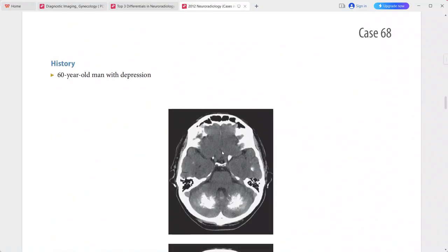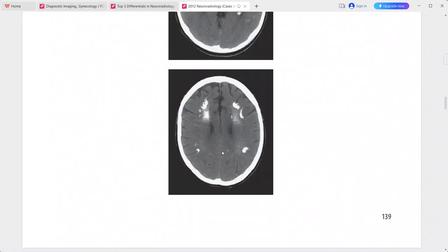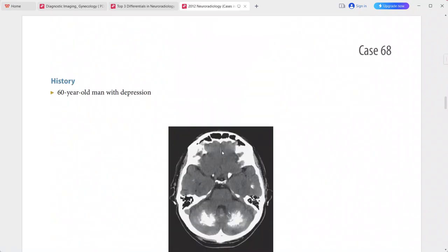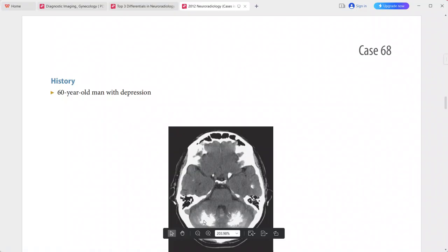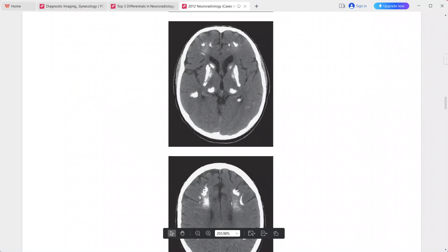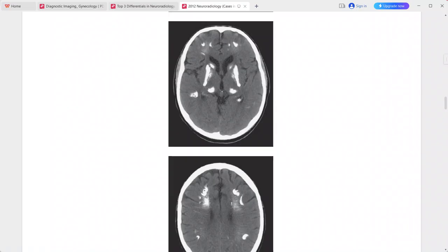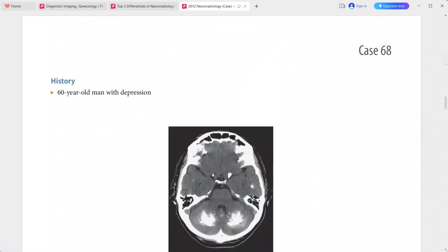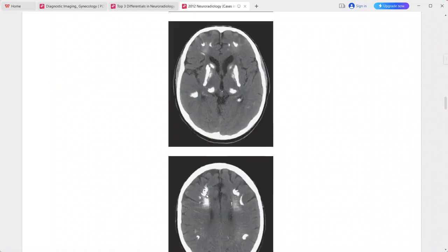Next: a 60-year-old man presenting with depression. CT shows symmetric areas of calcification centered in the dentate nuclei, lentiform nuclei, bilateral thalami, and subcortical white matter. This is a typical imaging picture of Fahr disease.